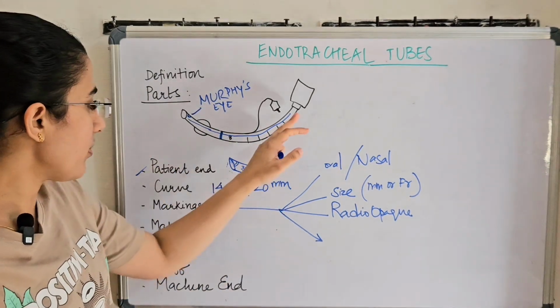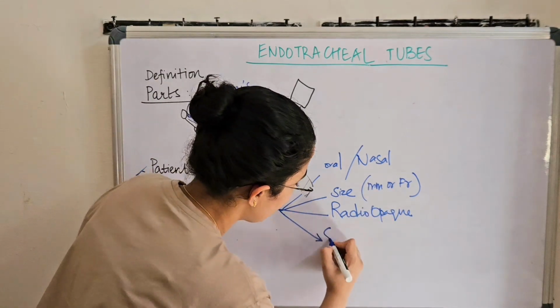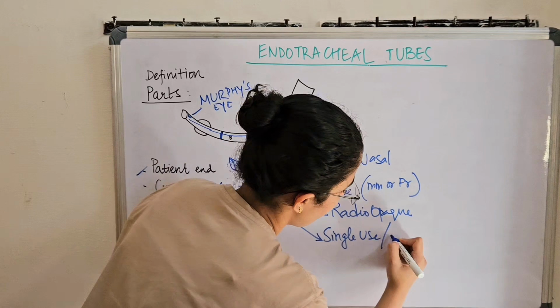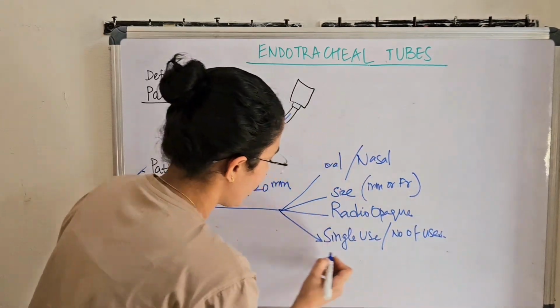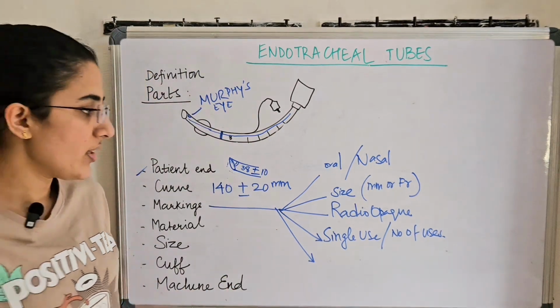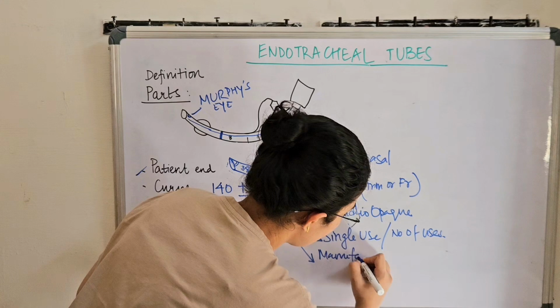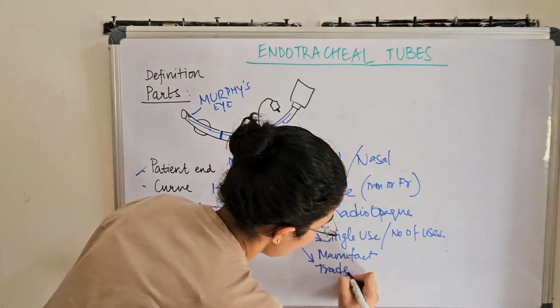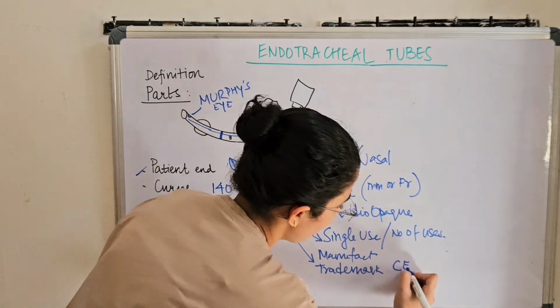Okay. Apart from all these markings, we may have the wrapper of the tube containing written whether it is a single use or the number of uses it is allowed after cleaning or after autoclaving. And the last one which we always see is the manufacturer's name, details, and also certain trademarks which may be written, like Conformité Européenne.